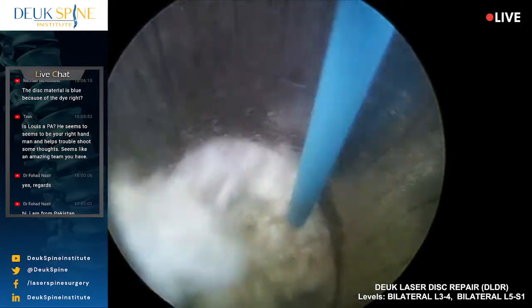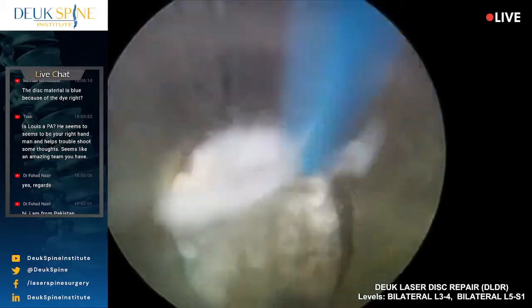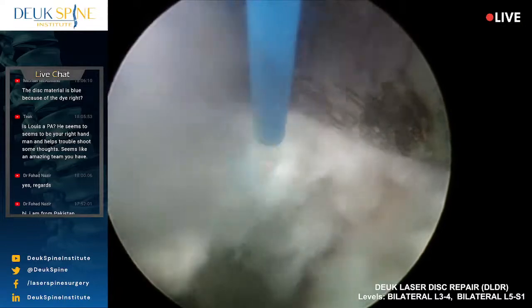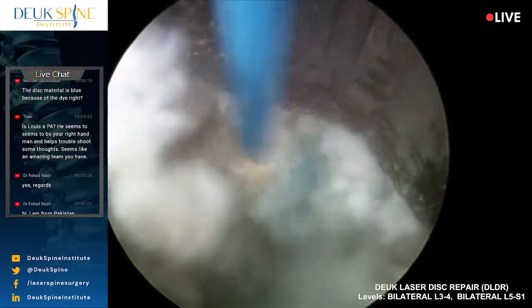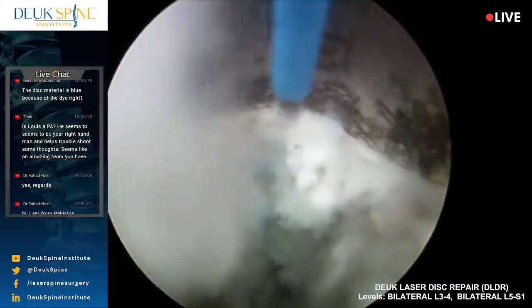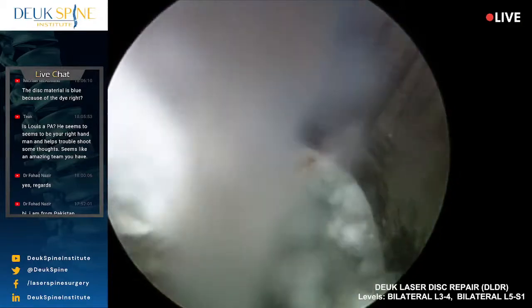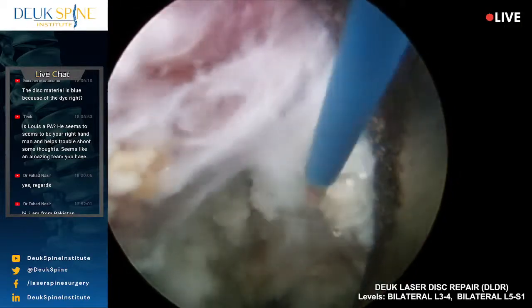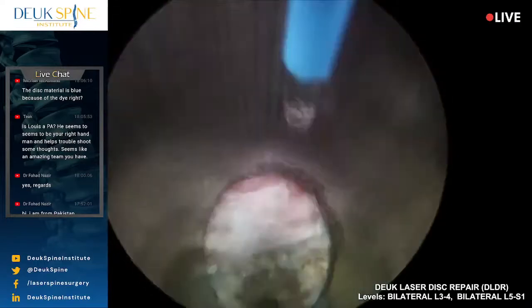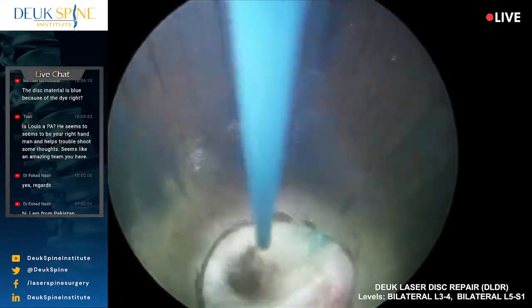Oh, we're finally pretty much done with this crazy disc. I may have used more energy on a disc, but I've never, ever spent as much time on a disc. That's for sure. But some are quick, some are long. You just gotta be prepared to do what it takes, you know?